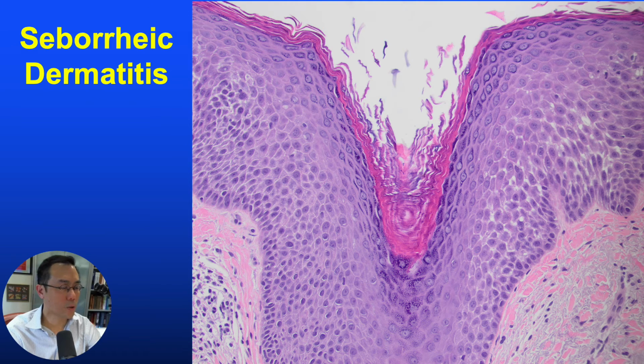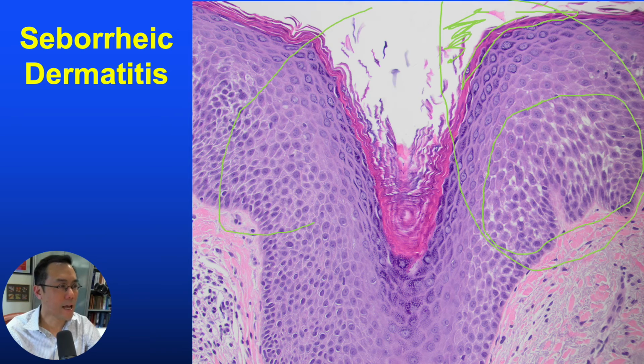And although the phrase shoulder parakeratosis is used, one doesn't necessarily always see parakeratosis. So for example, this is a good example of follicular spongiosis. I do not really see the parakeratosis. I see compact orthokeratosis, probably with some nuclei there, but I see more prominently spongiosis at that shoulder. And so it starts with the spongiosis, and then you can get parakeratosis, and then typically neutrophilic crust over that. So basically the shoulder is the epicenter, but one doesn't necessarily have to see parakeratosis.